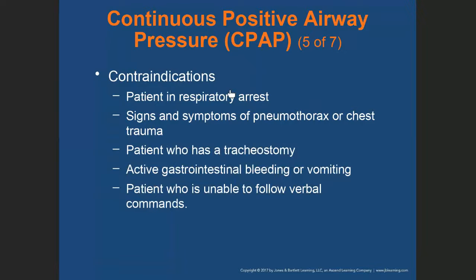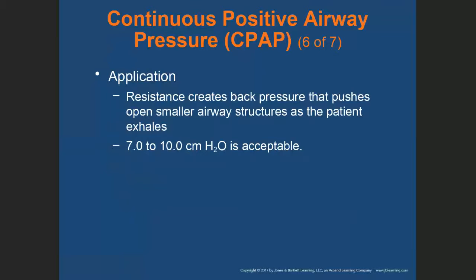Contraindication: the patient is in respiratory arrest, if they have a collapsed lung or trauma to the chest, they have a tracheostomy, gastrointestinal bleeding or vomiting, or they are not able to follow commands. Application: resistance creates back pressure that pushes open smaller airway structures as the patient exhales.